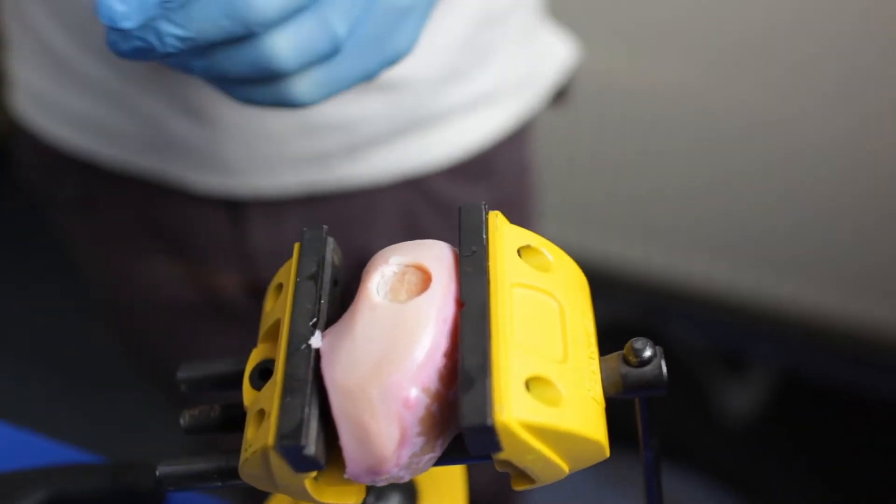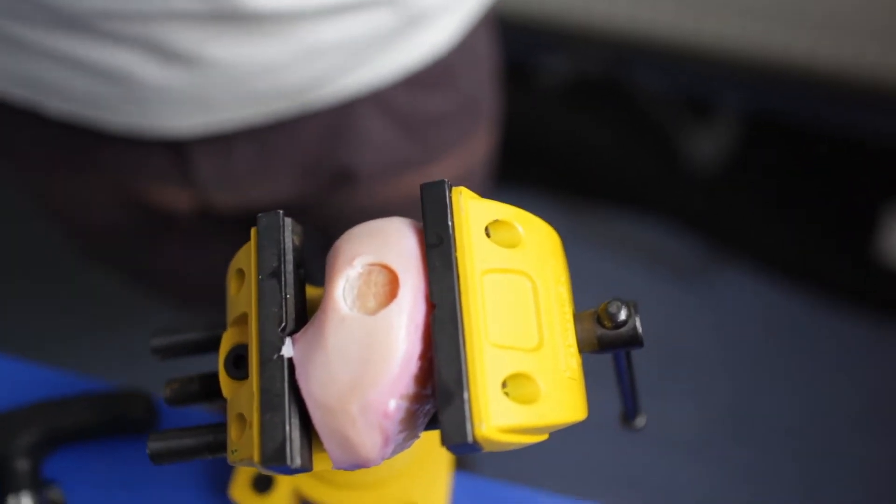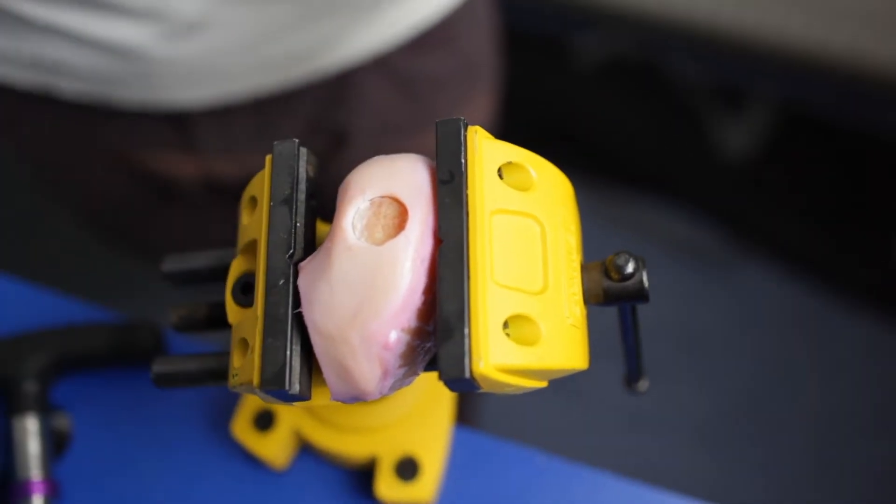This leaves you with a perfect disc cut. You can debride that further if you wish, if there's a sliver of cartilage left.